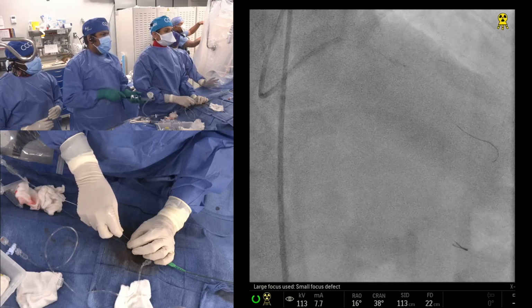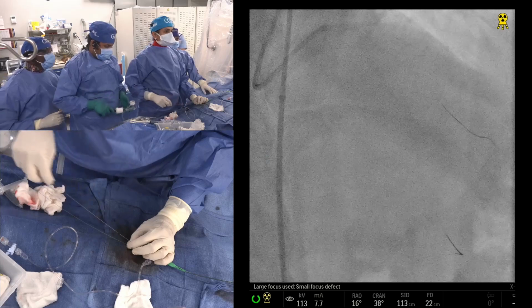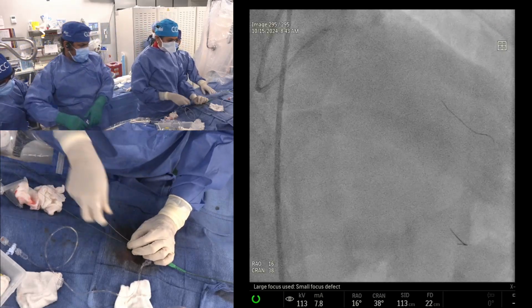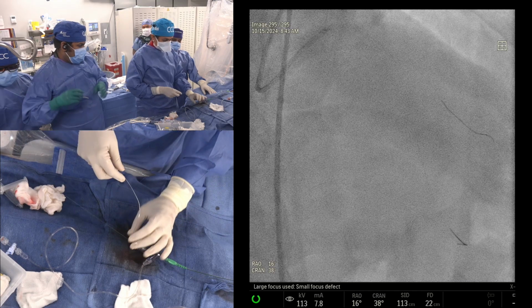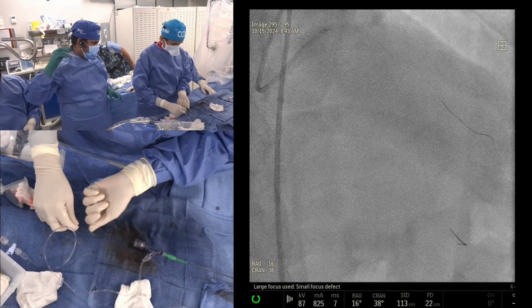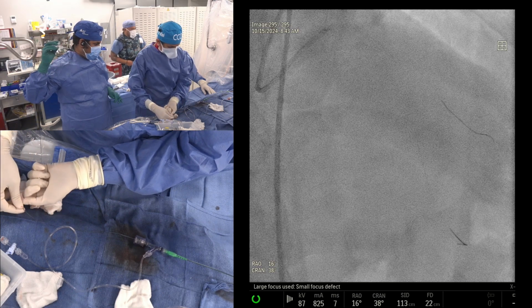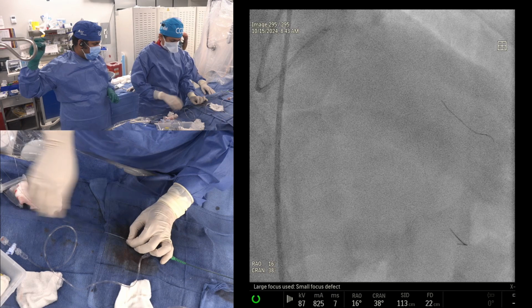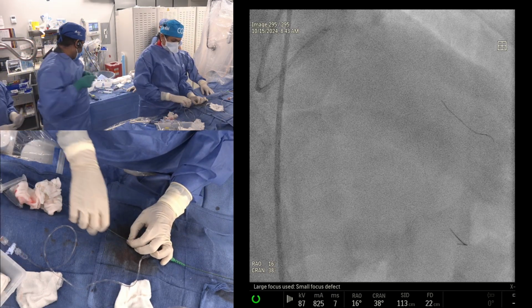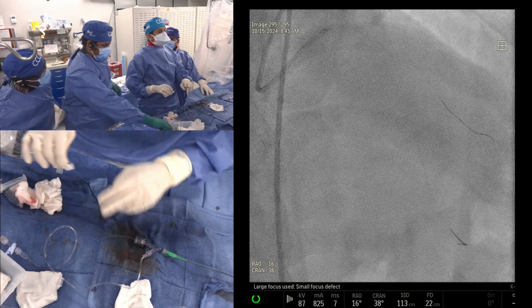If I can read this question between the lines, to help people's thinking, the intent may have been that if you fail one or two attempts with the CTO intervention, then this patient, being young and with the possibility of a left internal mammary to the LAD, would be referred. I think failure of LAD recanalization and then referral for CABG is appropriate.